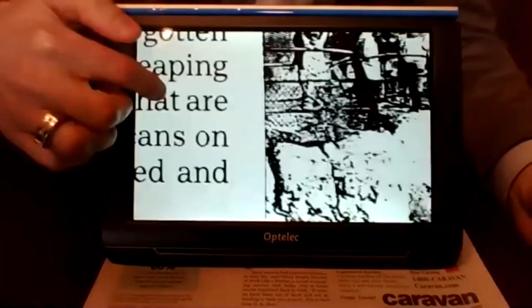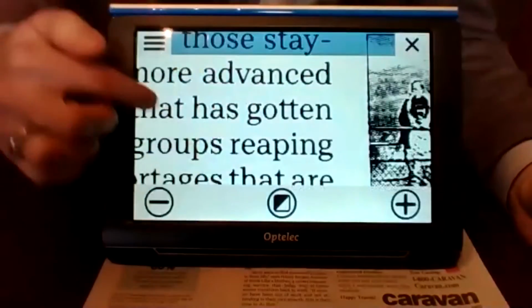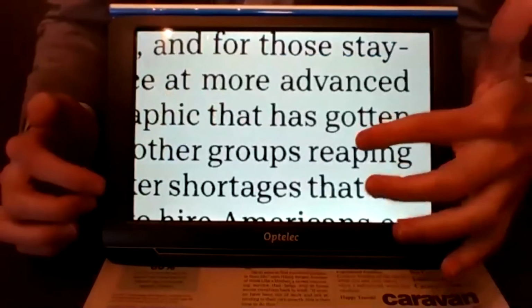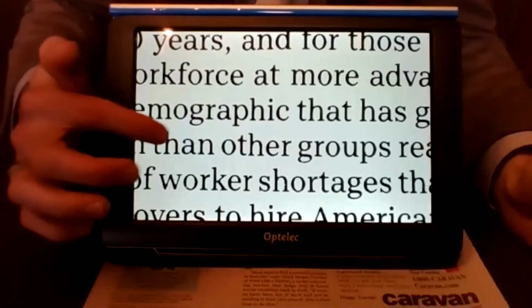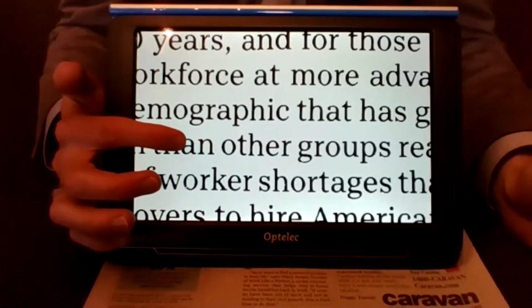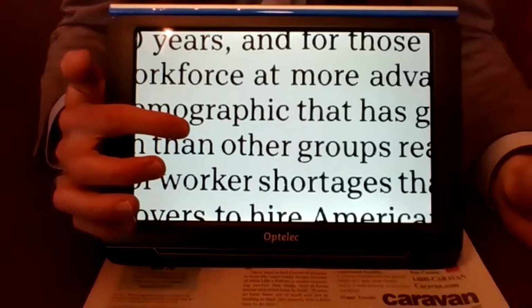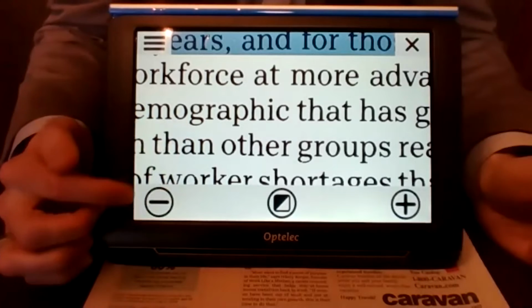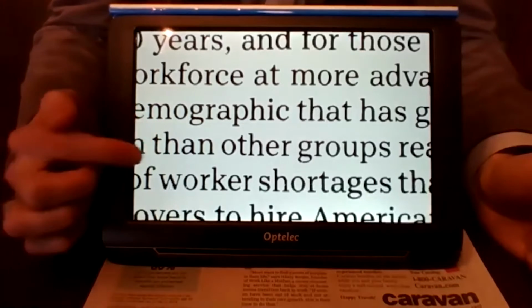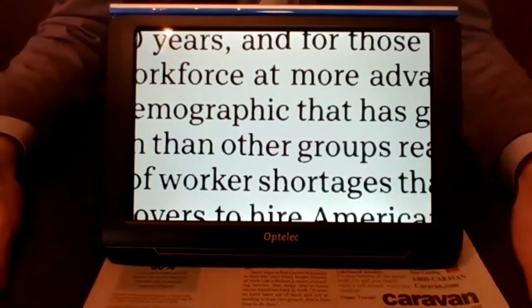I love this feature. If people are trying to access a lot of text, it can be difficult to navigate. We have the option in OCR that can produce a different digitized image in a scrolling manner. But if you're just using magnification, anybody familiar with these types of devices will know you're often moving the material on an XY table or sliding it across a table under the camera to try and read and navigate text.